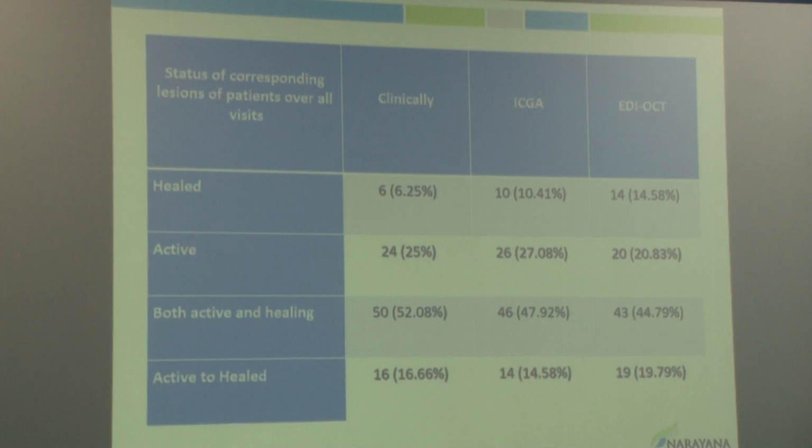When we analyze the data of these patients clinically, on ICGA and EDI OCT, we looked at the number of healed lesions seen. EDI OCT shows a significant number of more eyes having healed lesions compared to the other two modalities that we used. Active lesions were again slightly lower when it comes to EDI OCT.